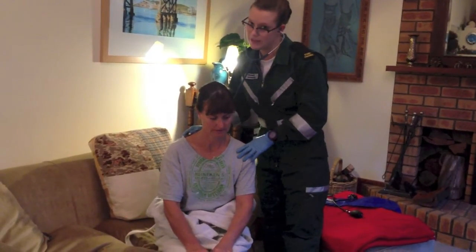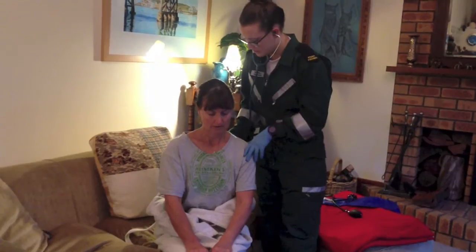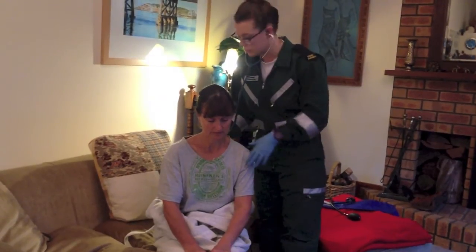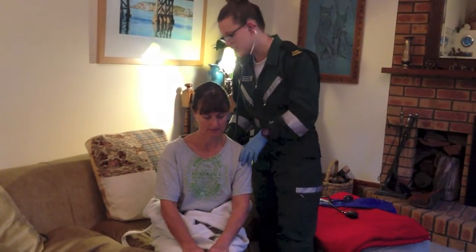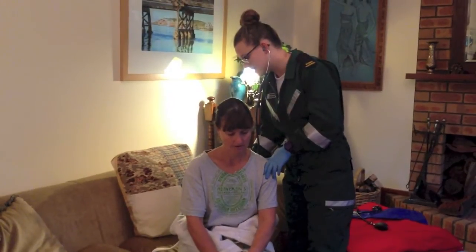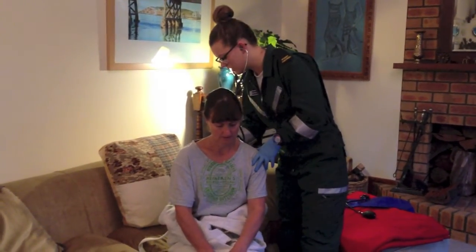So if I was doing this on the road, I'd actually ask the patient to lift up their top. But for this video, this should be fine. I asked the patient to cough so that she cleared any sputum that might have been at the top of her chest that might affect the sounds. And just listening to hear if left and right sounds are equal, or if there's air entry to their bases, and to make sure the sounds are normal, there's no wheezing or crackling or anything abnormal.